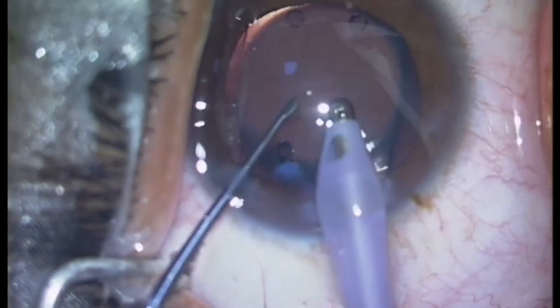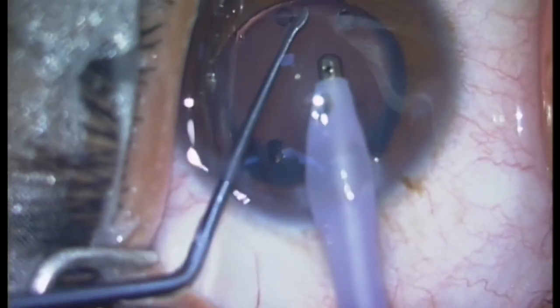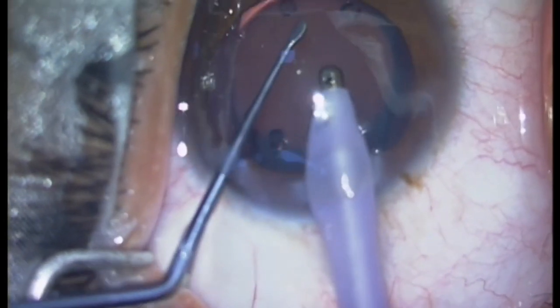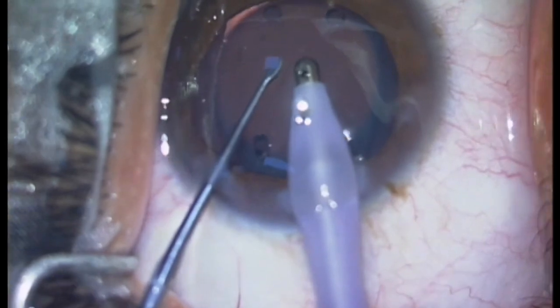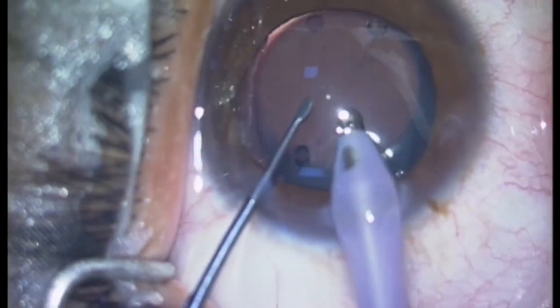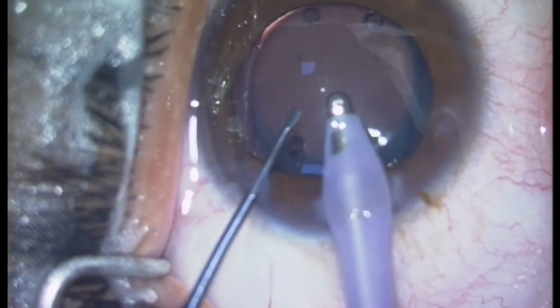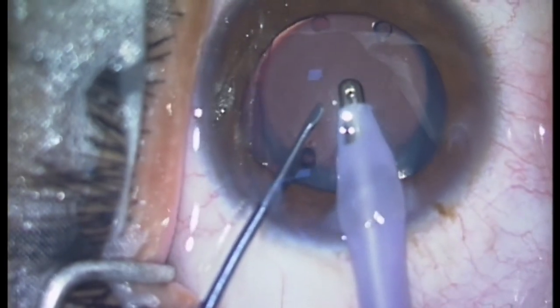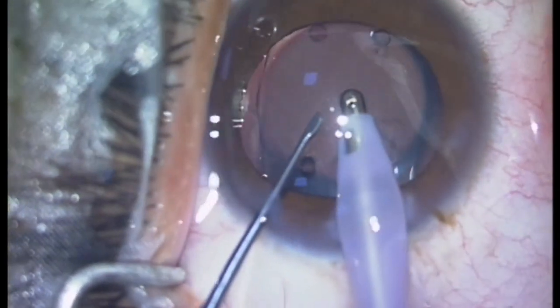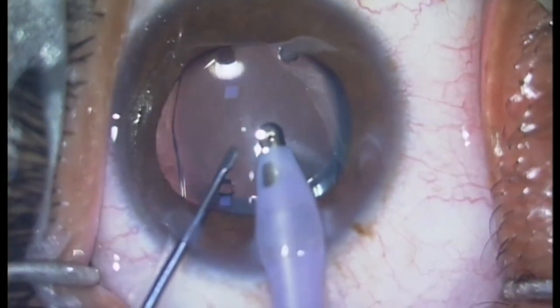A gentle tap is done over the surface of RIOL to remove viscoelastics from the interface between the RIOL and the surface of the crystalline lens. Complete removal of viscoelastics is mandatory to prevent any post-operative intraocular pressure spikes.